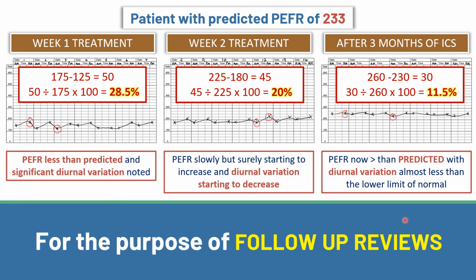And what I'd be saying to this patient is, can I see you again in 3 more months? And can you bring me in a couple of weeks' worth of this in 3 months? And what I'd be expecting in 3 months is for this to have dropped to less than 10%. So I hope that that's been useful.